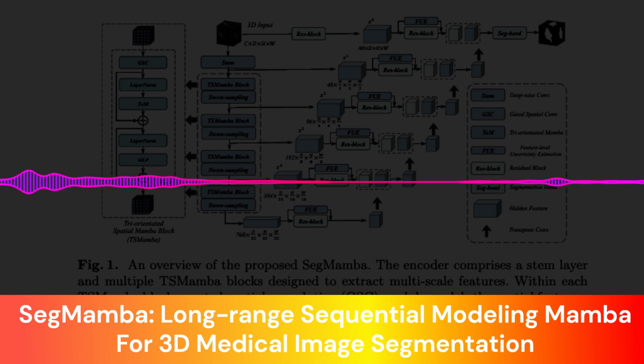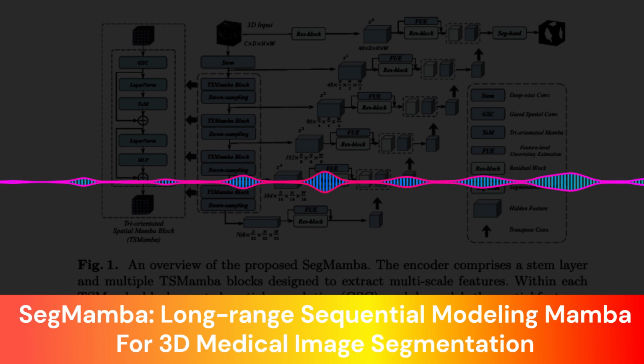Right. So the big question, how did SegMamba perform on CRC 500 and other tests? They tested it thoroughly, not just on CRC 500, but also on two other major benchmarks. BraTS 2023 for brain tumor segmentation in MRI. Right, that's a standard one. Different imaging modality, too. Exactly. And AIIB 2023, which is for segmenting airways in CT scans, of very different structure, like a branching tree. Testing on all three really shows how generalizable the method is.